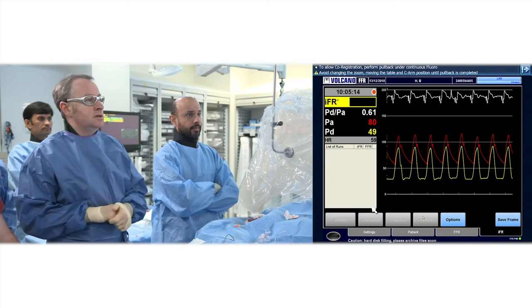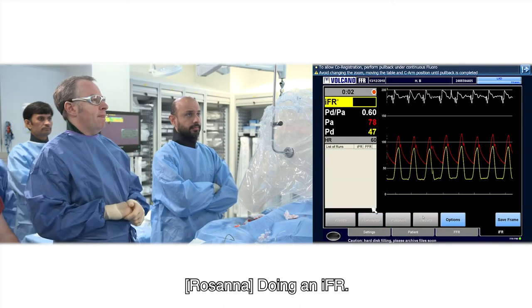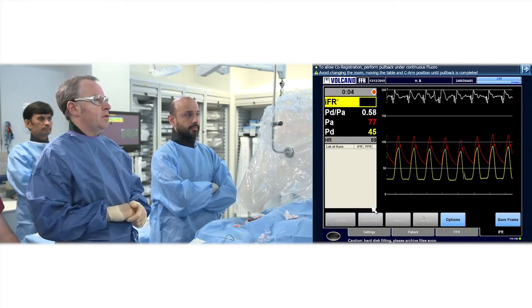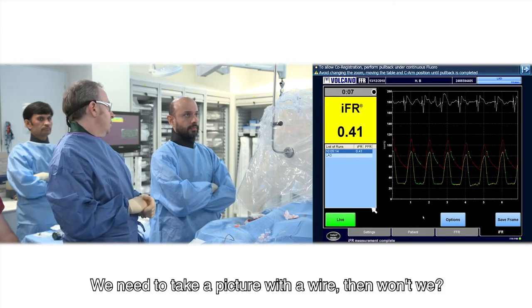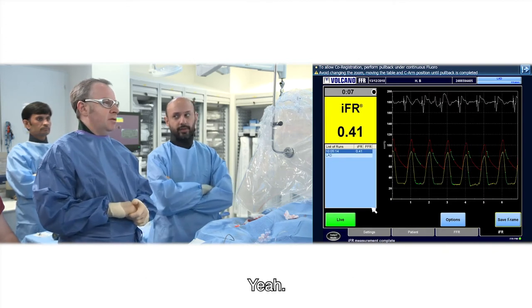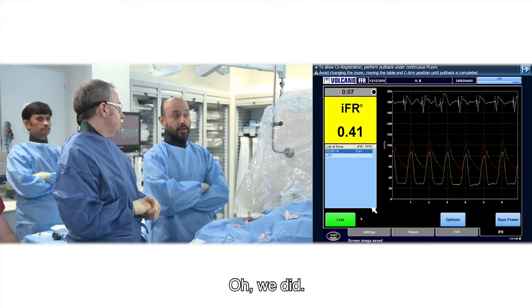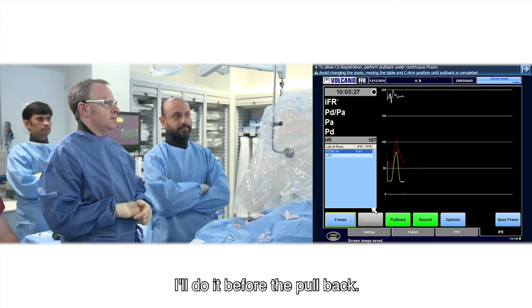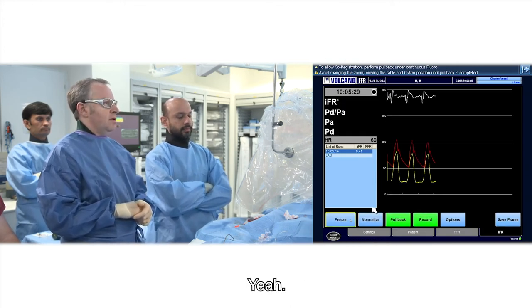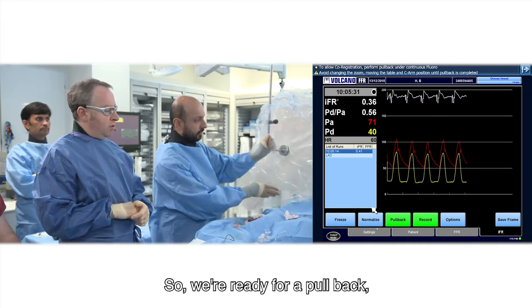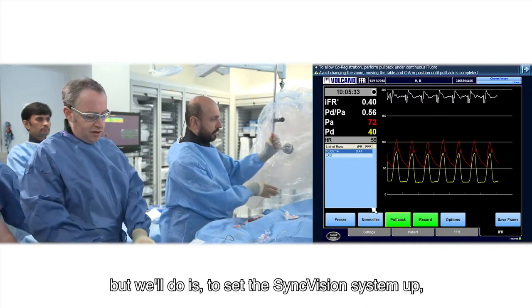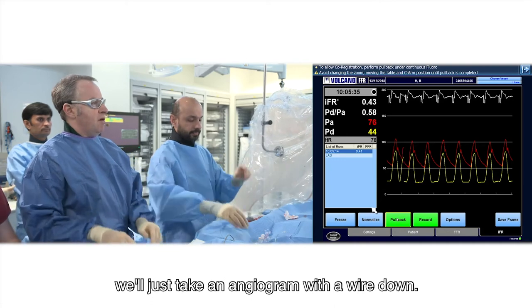We need to take a picture with the wire down, won't we? I'll do it before the pullback. So we're ready for a pullback, but what we'll do to set the sync vision system up is just take an angiogram with the wire down so it knows where we are.